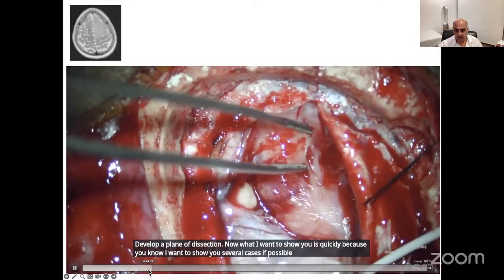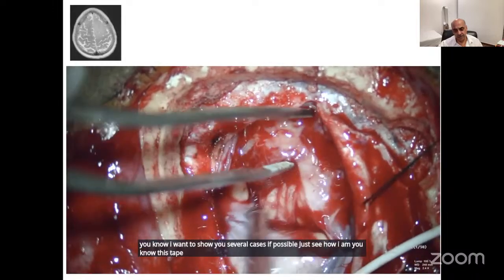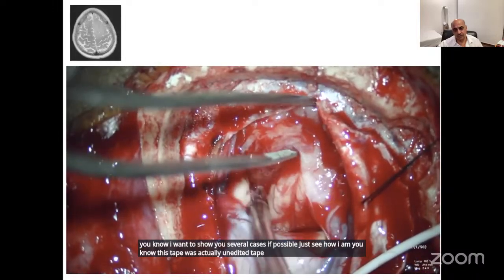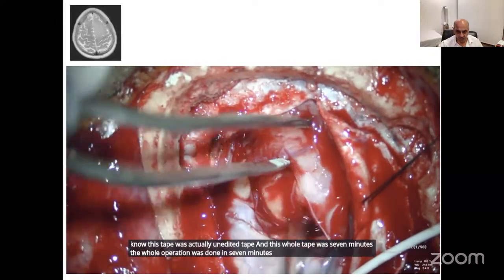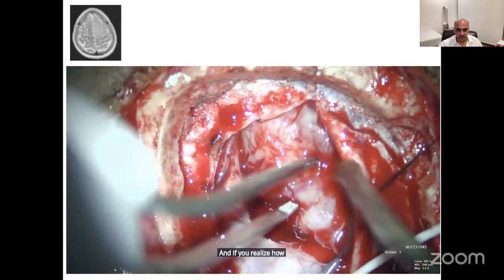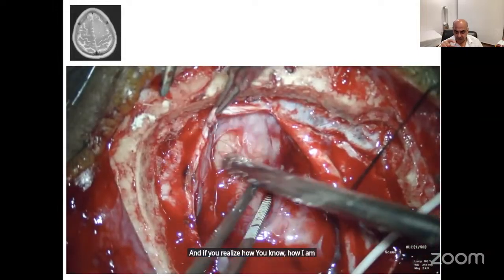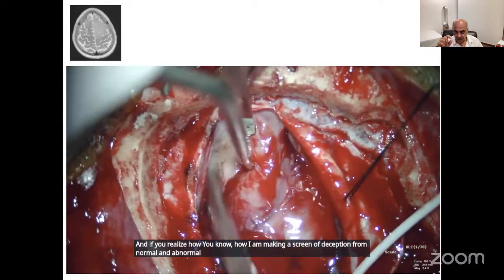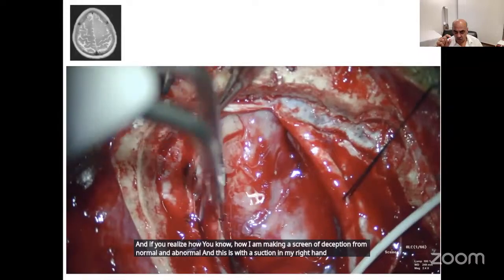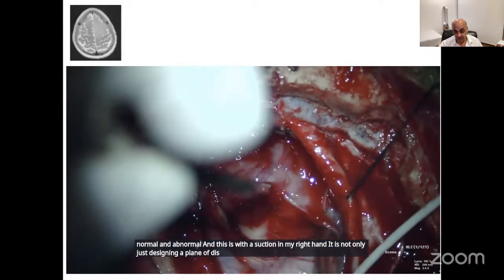Now, what I want to show you quickly, because I want to show you several cases if possible, is this tape, which was actually unedited. The whole tape was 7 minutes. The whole operation was done in 7 minutes. And see how I am making a plane of dissection between normal and abnormal, with the suction in my right hand. It is not just designing a plane of dissection in a very, very critical area of the brain.